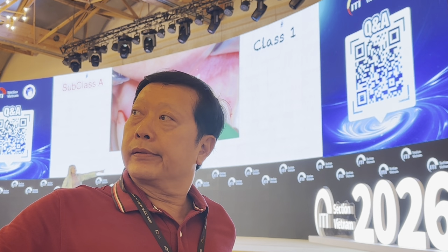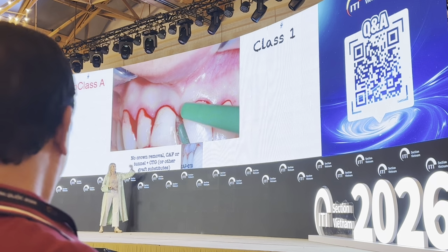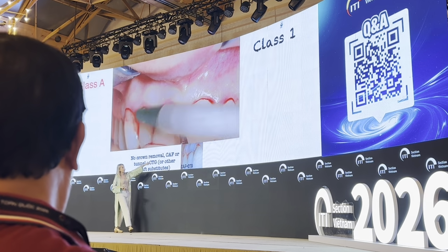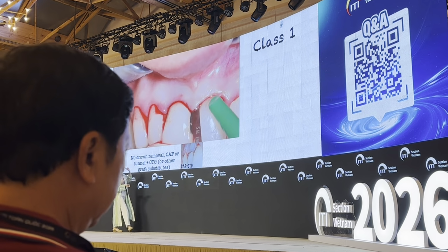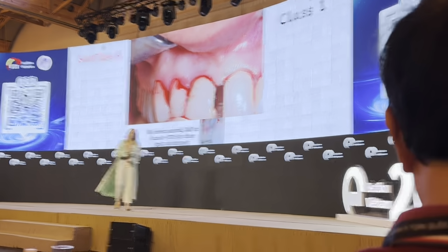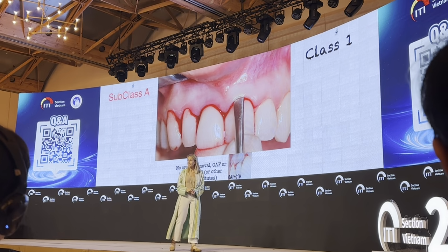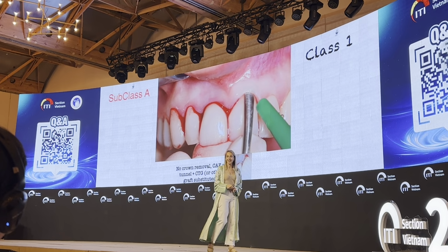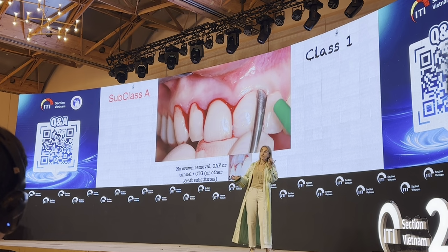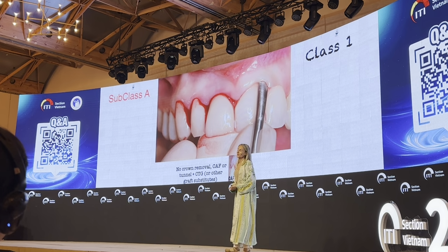As you can see in the article, what we said is that you don't have to remove the crown and you can perform a coronally advanced flap or a tunnel procedure. This is because we wrote the article along with our friend at the Michigan University, who are more used to performing the tunnel technique. So, to be fair, we wrote that you can also do tunnel.